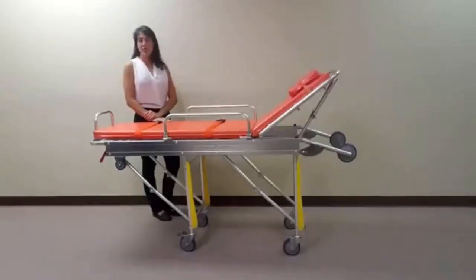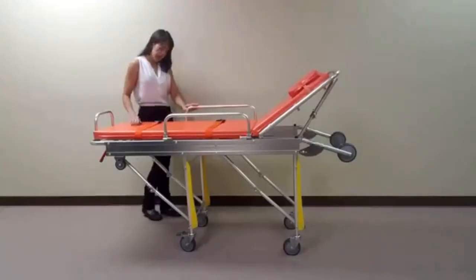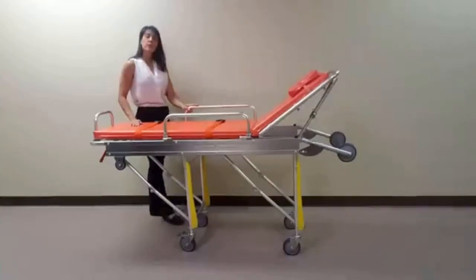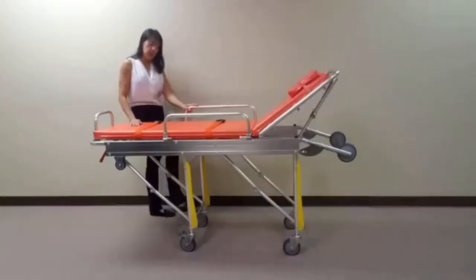This unit comes standard with two lockable swivel wheels, allowing the stretcher to be easily maneuvered and secured next to a bed or chair for easy patient transfers. To lock the caster, push down on the gray lever located on top of the wheel. To unlock, press down on the green lever.